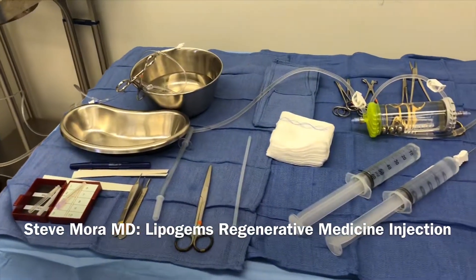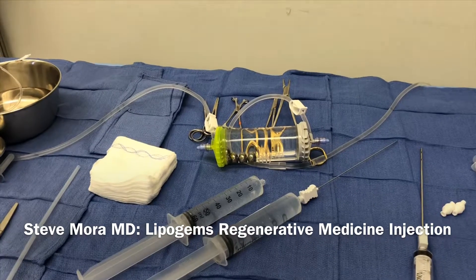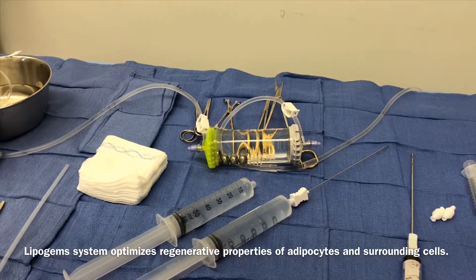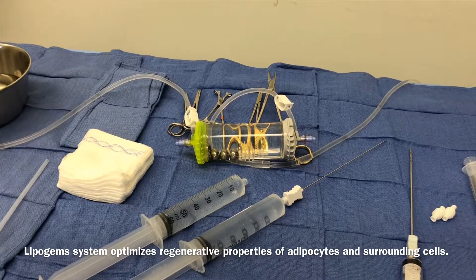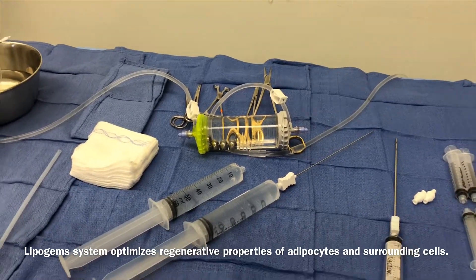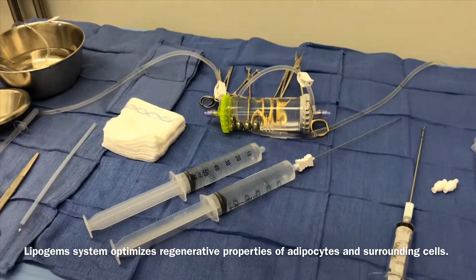Here's a setup for our regenerative procedures called LipoGems. That's a LipoGems canister. It has these big metallic BBs within it. We're going to be injecting harvested fat into that canister. It has high-tech patented filters that will remove the oils and tissue that's not necessary and will create something that we can inject into the knee.